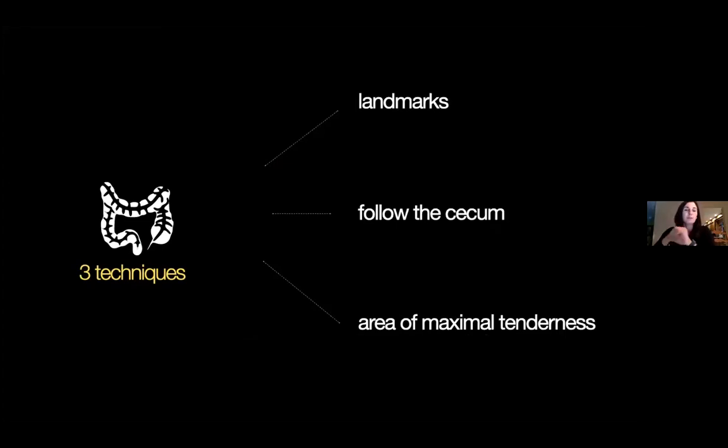Okay, so let's go into the three techniques I want us to discuss a little bit more in detail today. The first technique is the landmarks, and actually that's the most reliable one. So in every patient, you're going to be able to do that one.